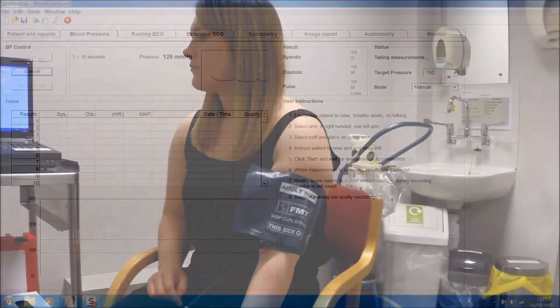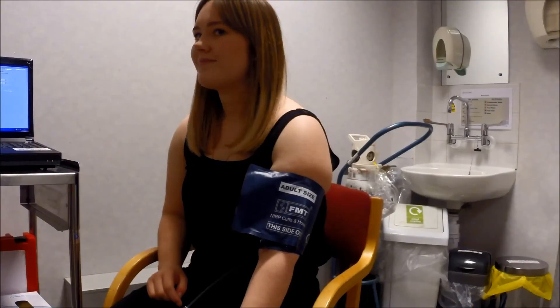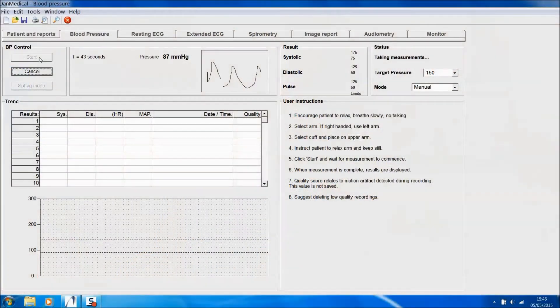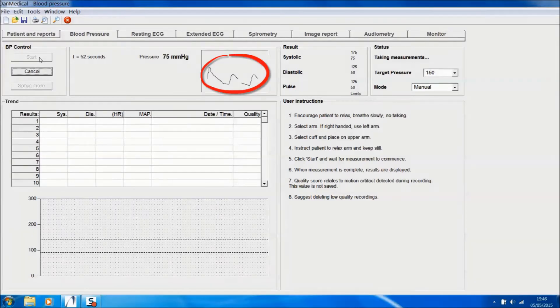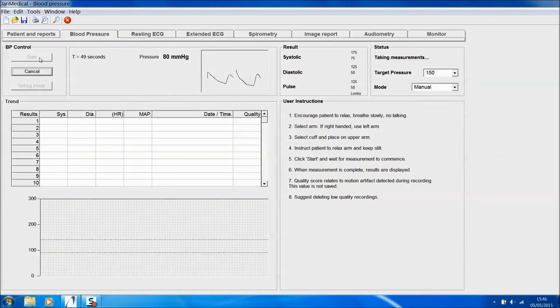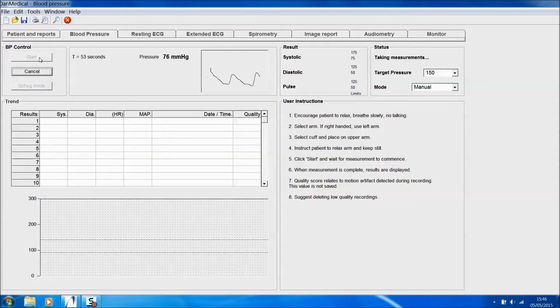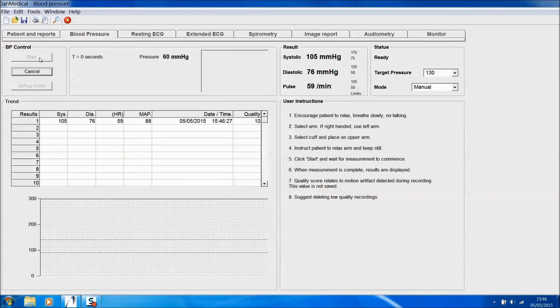Pressure in the cuff reduces automatically. There's a visual indication of the oscillometric pulse height on screen. Pressure in the cuff continues to be reduced automatically until the test completes.